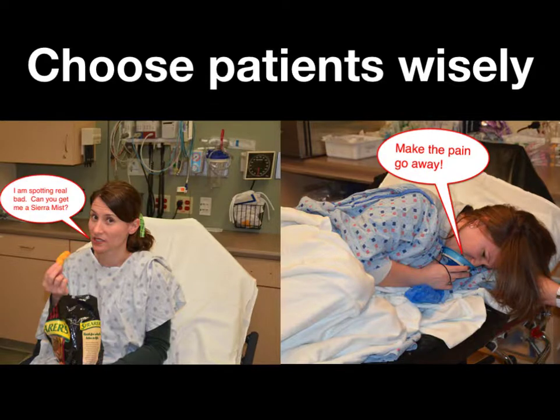A benign-looking patient with spotting who has an intrauterine pregnancy, no free fluid, and you have no concern for any other intra-abdominal pathology can be discharged home. Somebody who comes in complaining of severe lower abdominal pain, even if you were able to diagnose an IUP with a focused exam, you still haven't explained why the patient is having such severe pain. So keep that in mind when performing this exam and any other focused ultrasound exam.